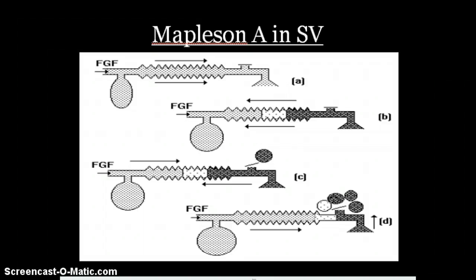Once the reservoir bag is full and pressure builds, the expiratory valve opens and the alveolar gas containing CO2 is vented into the atmosphere. During expiratory pause, alveolar gas that collected in the corrugated tube is also pushed out through the valve, as long as fresh gas flow is high enough. The system is filled with fresh gas and dead space at the beginning of the next inspiration, when fresh gas flow equals alveolar ventilation. If fresh gas flow is higher than minute ventilation, all of the alveolar gas and dead space gas is vented out of the valve, as well as some fresh gas.